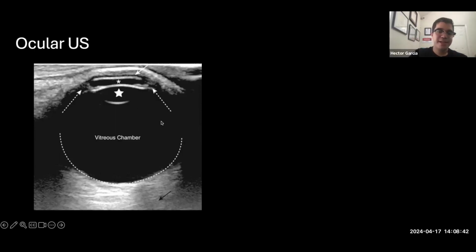What's interesting is that if someone undergoes ocular trauma and you cannot use the normal tools to look in the eye, you can do an ocular ultrasound with the eyes closed. Very, very amazing.